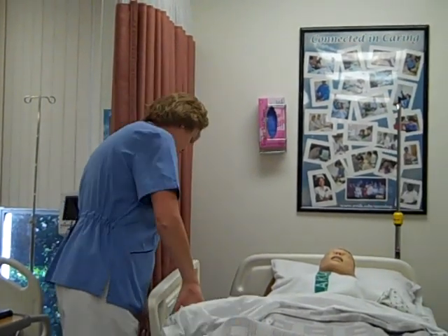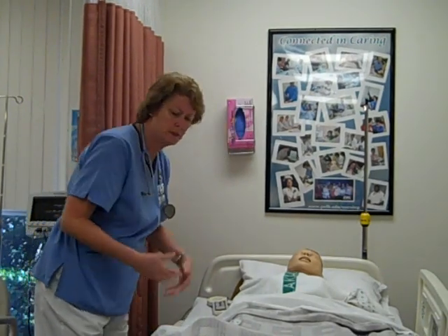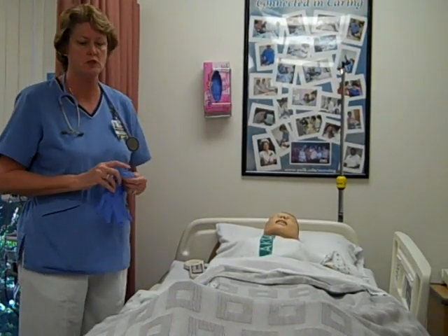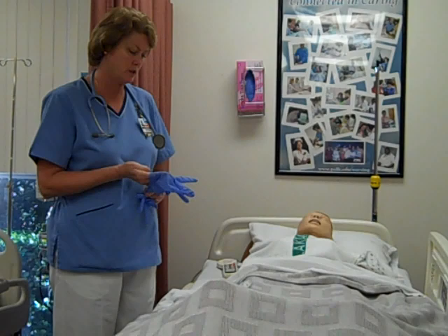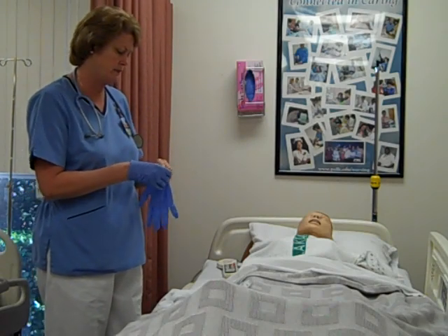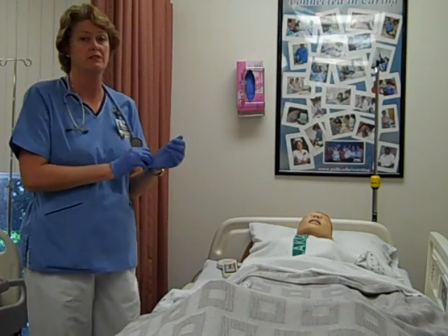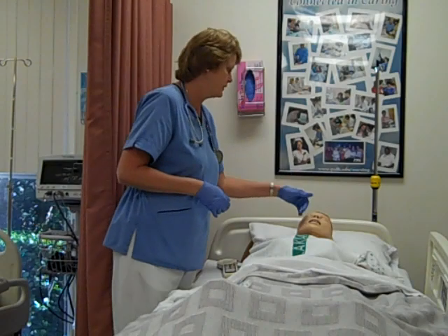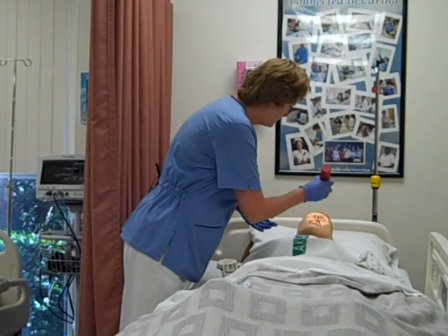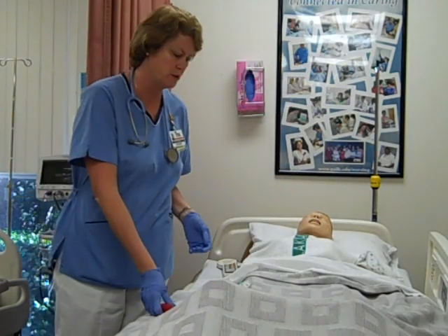So we're in the patient's room. First, we would want to do an abdominal assessment — it depends on why we're putting this tube in. We would have listened to their bowel sounds, checked for distention, and all of that first. We've told the patient what we're going to do. We would want to ask them if they've had any problems with either one of their nares — do they have a deviated septum? Is it easier for them to breathe on one side or the other? You could use a flashlight to do a little inspection and see which side would be better.